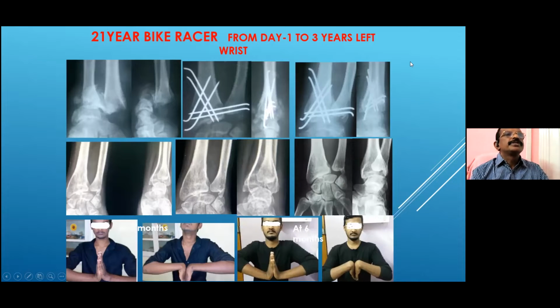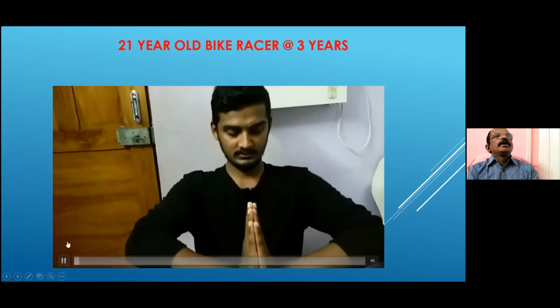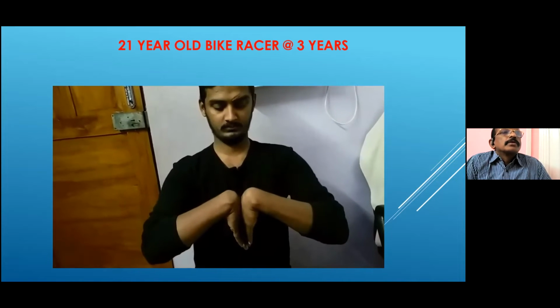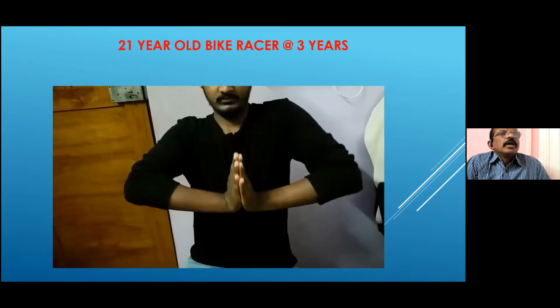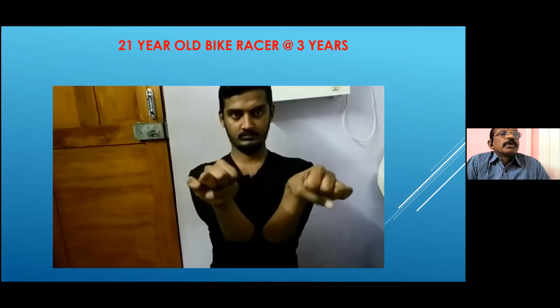This is from day 1 to 3 years of the left wrist. You can see this pre-op X-ray, post-op X-ray, and also X-ray before wire removal, after wire removal at 90 days, and at 1 year and 3 years. There is not even a single stepping. You can see this range of movement from the pictures also. It's the same person. You can see the video at 3 years. The important thing is that this racer returned to his racing after 1 year, and he had done bike racing from Kerala to Nepal after 1 year of my surgery.